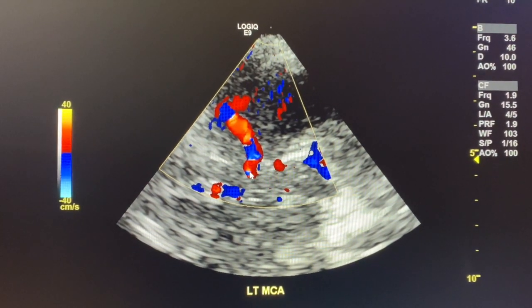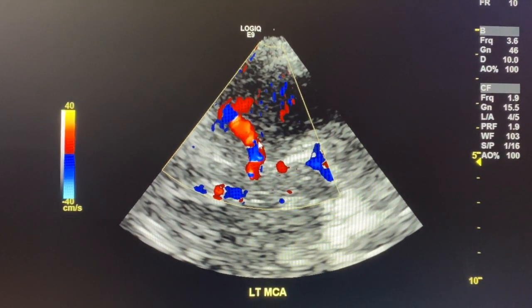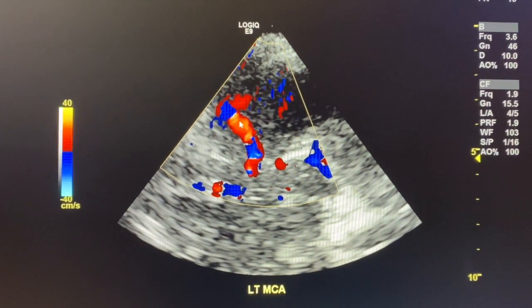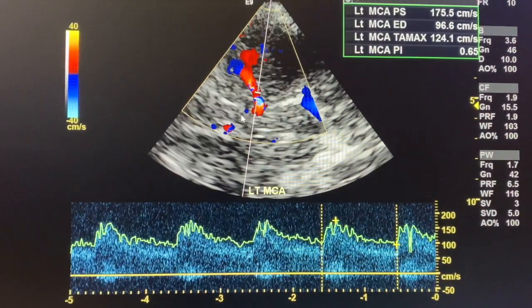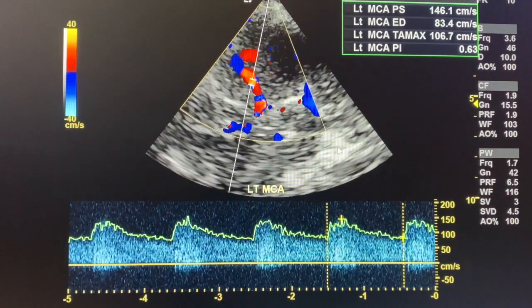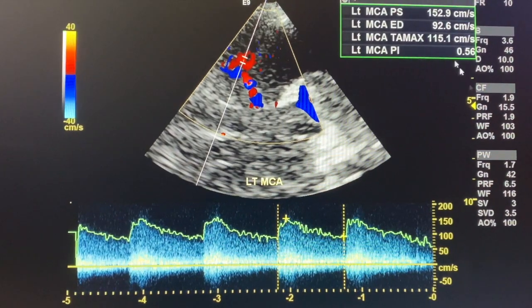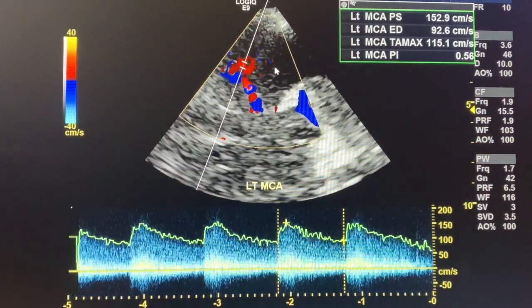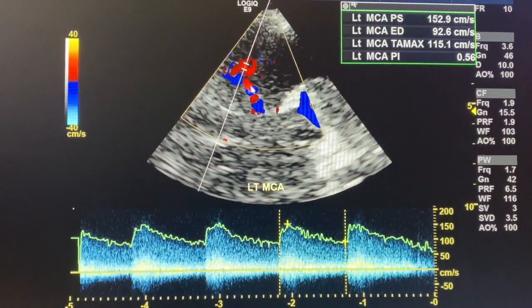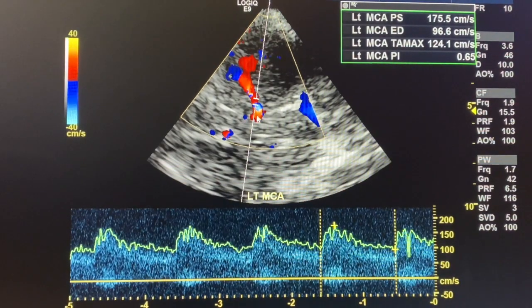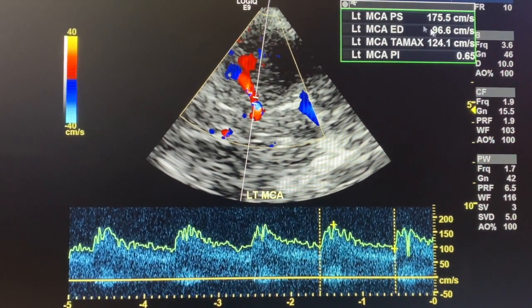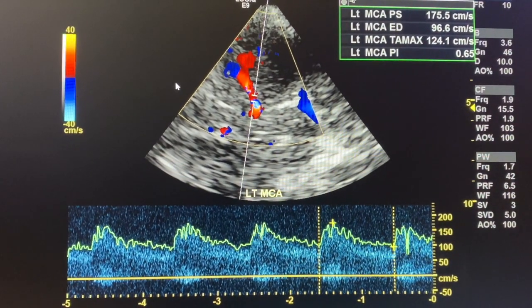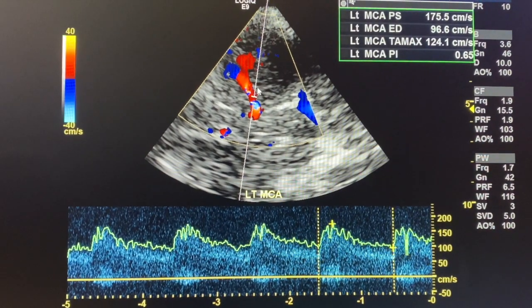We survey the whole vessel going down, finding which part has the highest velocity. We take three representative images — one, two, three — to capture the highest velocity while surveying the entire vessel. 124 cm/s is the highest on the left MCA.